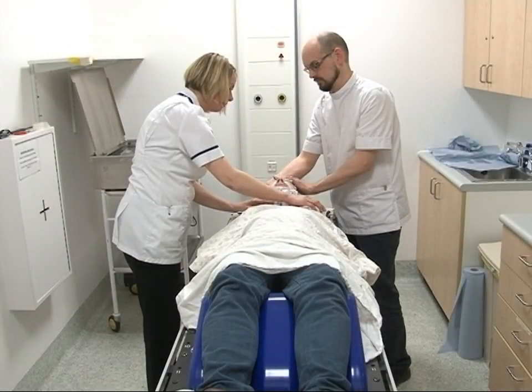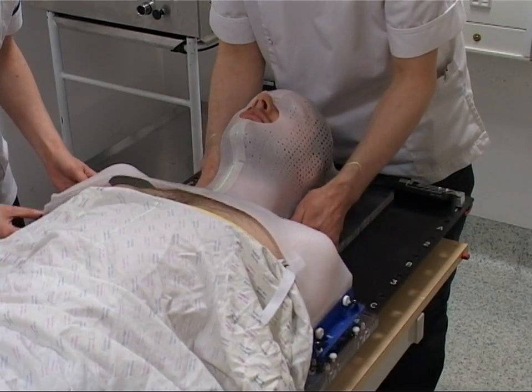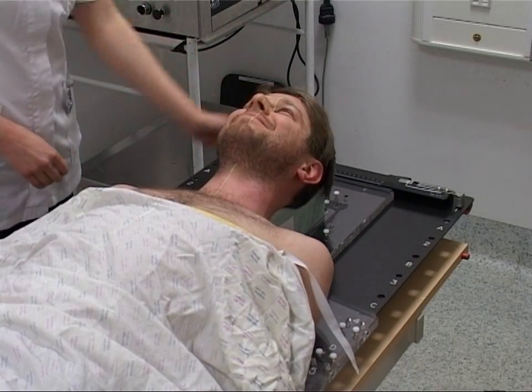The mask is close fitting, like a second skin, so may feel a little strange when you first wear it, but most people do get used to wearing it quite quickly.